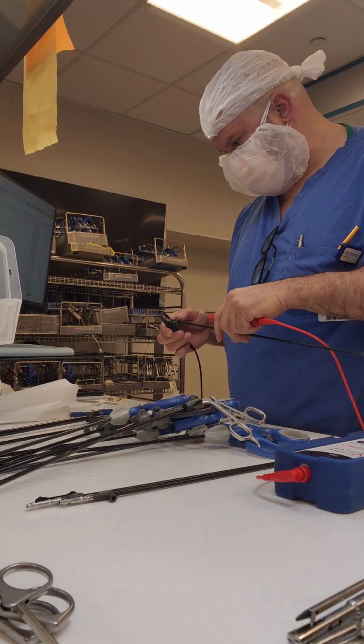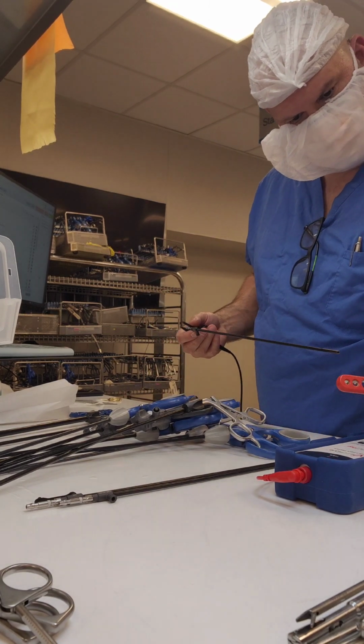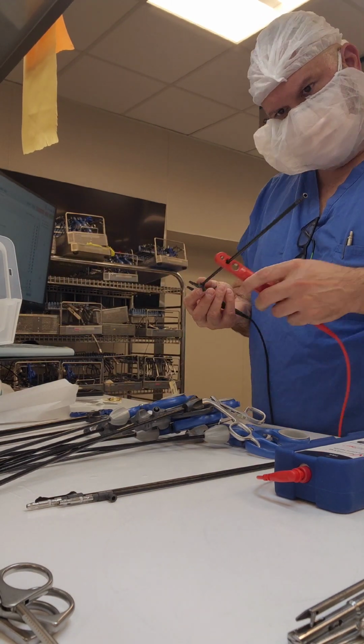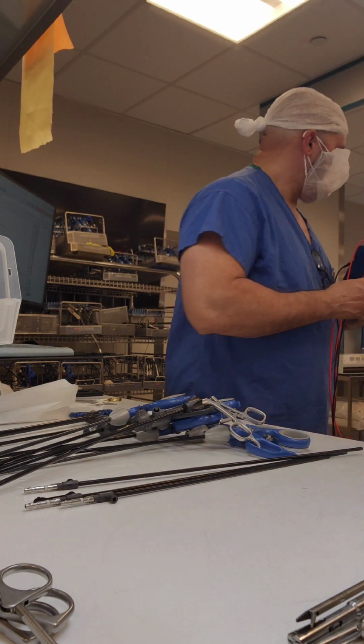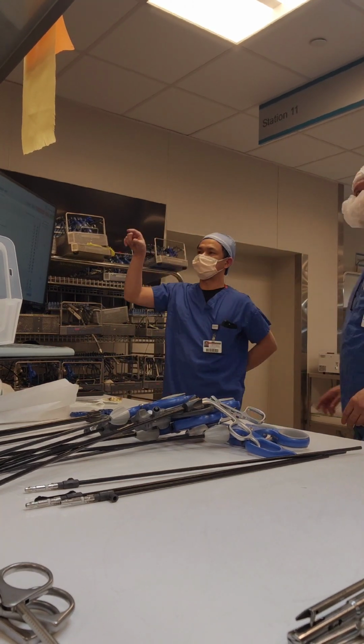All right, so I wind up finding those instruments. You see how long it took me to find them. And I have to test them as well, right? Make sure that they're good. So I'm testing these instruments. Okay, they passed the test. So I'm going to go ahead and put my little lap tester off to the side. Now it's time to check for cleanliness, right?